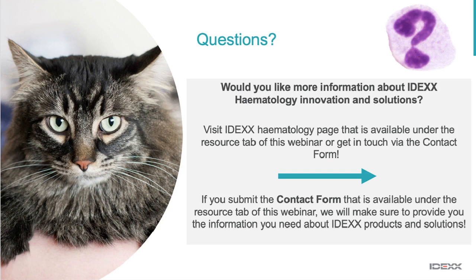The animal's hiding the disease itself, because that's a signal to you that there is something wrong with the patient. And I've seen so many cases now of Heinz body hemolytic anemia, immune-mediated hemolytic anemia, even mycoplasma infections, but a variety of those conditions where we find that. And that was the only clue. And by identifying that early, you need to go to the next step. And this first step is looking at the blood film.